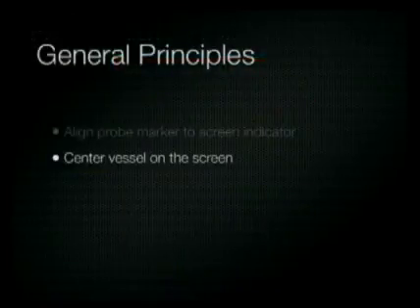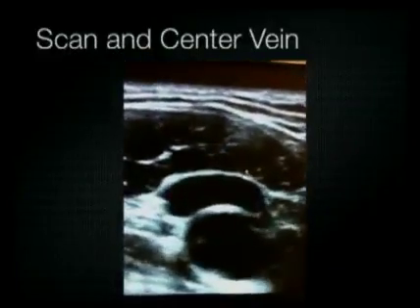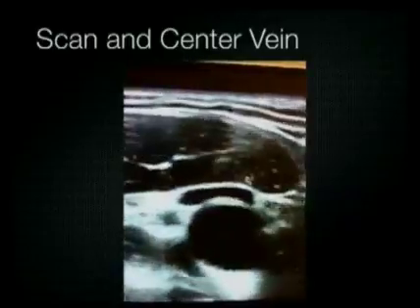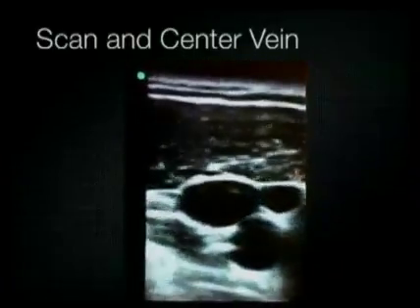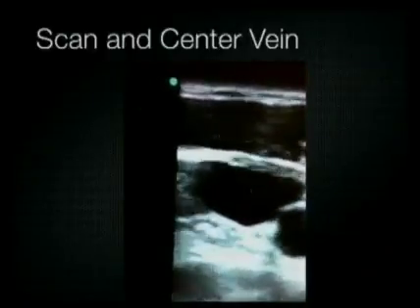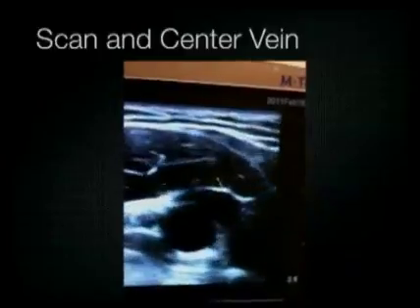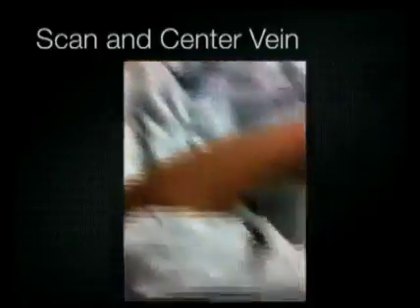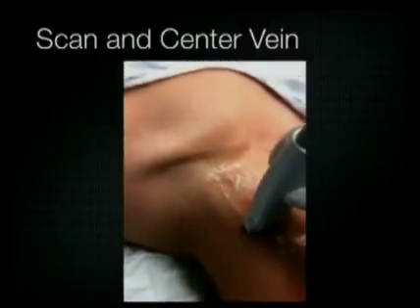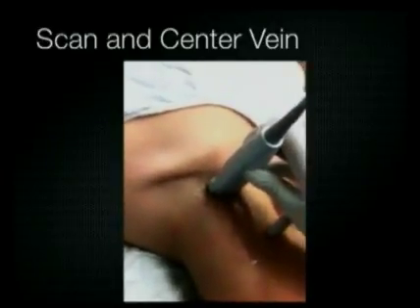Next, you want to center the vessel in the middle of the screen and scan up and down the vein to find the optimal place to cannulate the internal jugular. Ideally, find the spot where the vein is adjacent to and not on top of the carotid artery, and where the vein has the greatest diameter. Because you're not able to visualize the tip of the needle in the transverse view, it's possible to penetrate the entire vein and hit the carotid artery below it, so pay very close attention to where the carotid artery is.